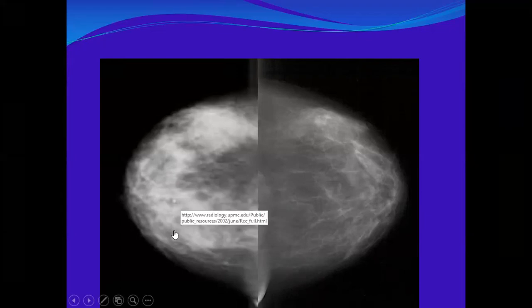I can see some densities here. I'm not sure about these densities. True calcification or not? Might be. I am expecting these to be extensive calcifications, but I am not going to exclude it, and I'm not going to mention it. I will say the image is suboptimal. The only abnormality I could appreciate is extensive global asymmetry. I need to proceed, and if I told you the patient has a palpable abnormality, so it will be.